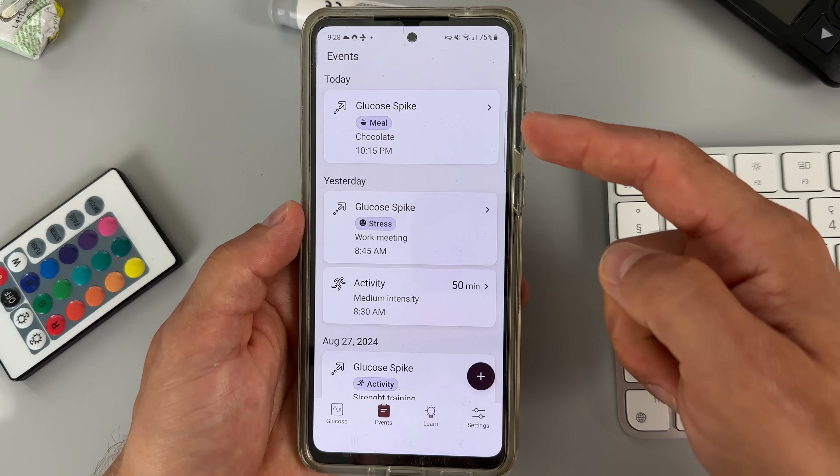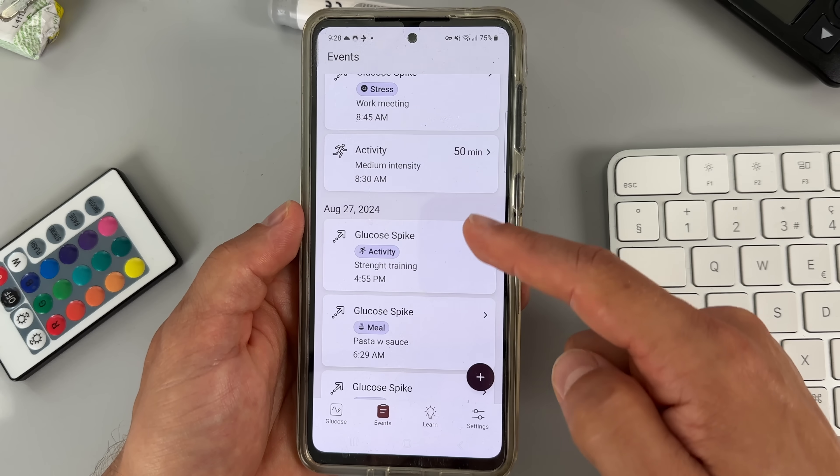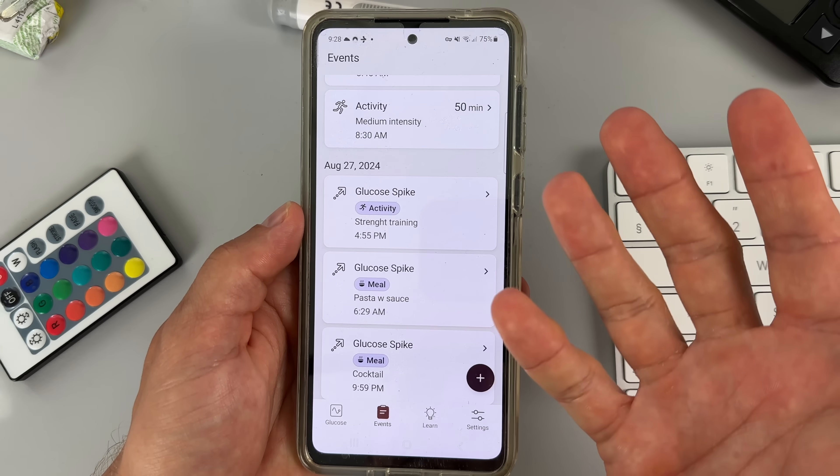I personally think that the spike detection feature would be a great addition to the Dexcom G7 app as well, even though the G7 app is more feature-heavy and advanced. What we didn't like is that all the blood sugar spike triggers and other logged events seem to disappear from our events log after two days. It would be really helpful to go back and review these things seven or even fourteen days back, but you can only see two days of history.